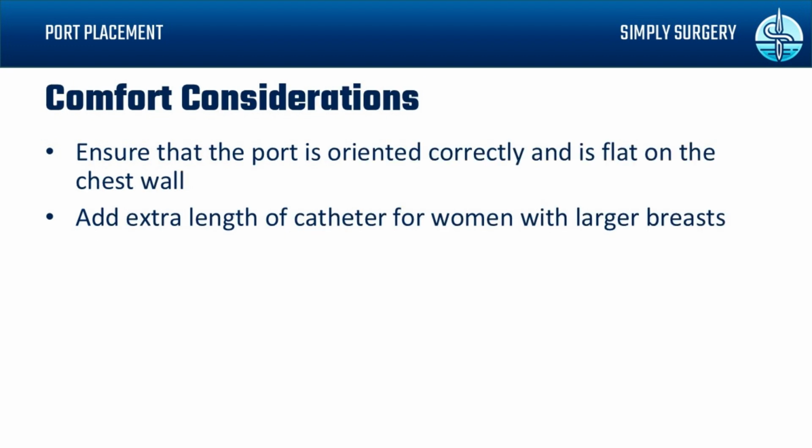And of course, I think it's important to touch on long-term discomfort issue. Taking a football to the chest does not feel like the best thing with a Port-A-Cath in, but what can you do to avoid those types of pain and misalignments that may come from having one in? Does that come from personal experience? I have to say yes on this one.